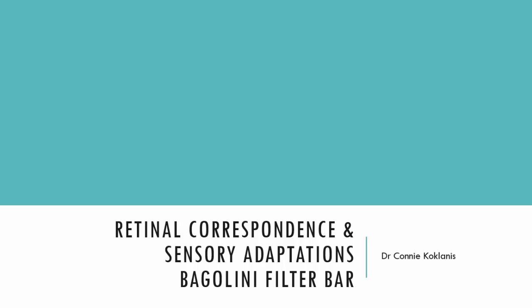What we can also do is measure the density of the suppression scotoma or the density of ARC. What do we mean by density? Density is telling us about how well entrenched that adaptation is. Let's say, as an example, you have a patient who's had a suppression scotoma from a very young age. It's been very stable, and we would expect that that suppression scotoma will be quite dense, very well established.